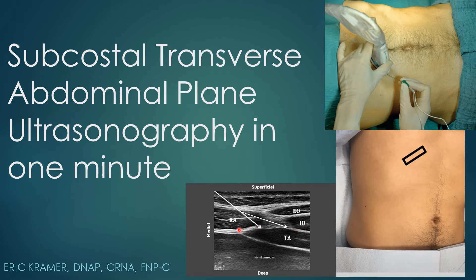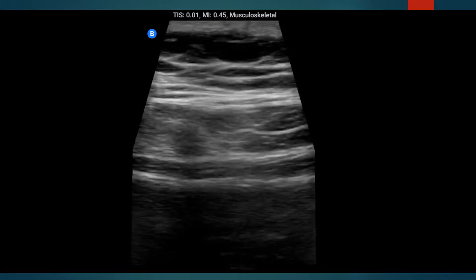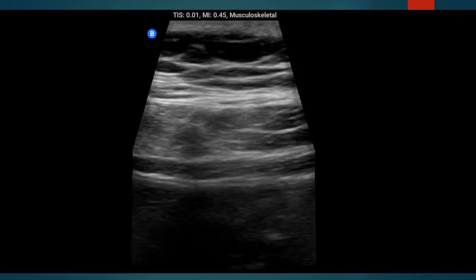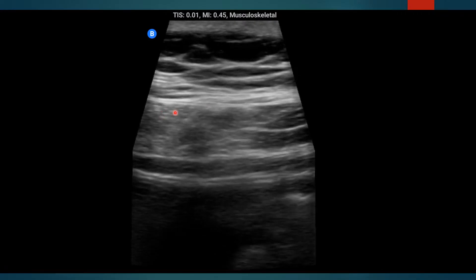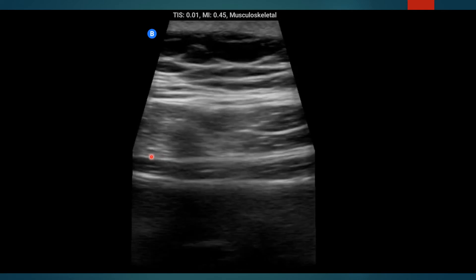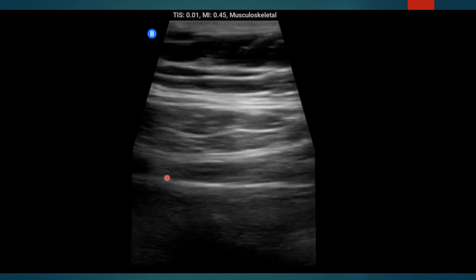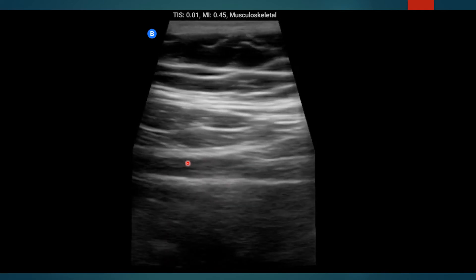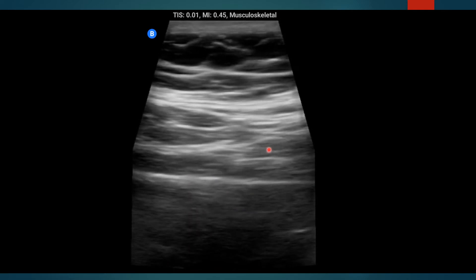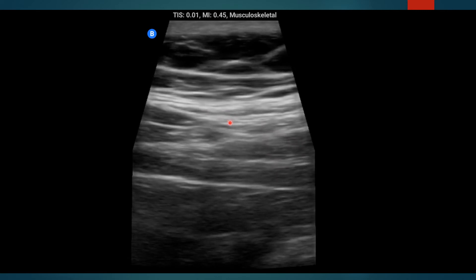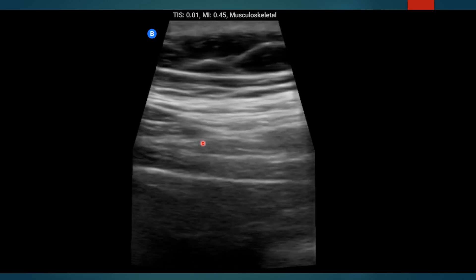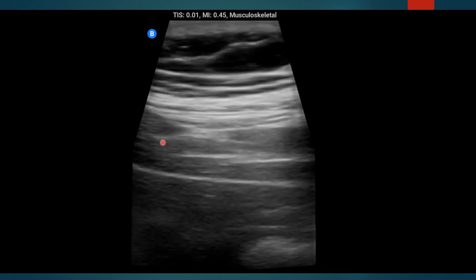However, it is okay to put it here, and this is a good target to go for. You can already see the rectus muscle here and the transverse abdominis underneath it. I'm going to start scanning laterally, and you'll see the aponeurosis of the rectus come into view with that fascial plane where you can do your injection.